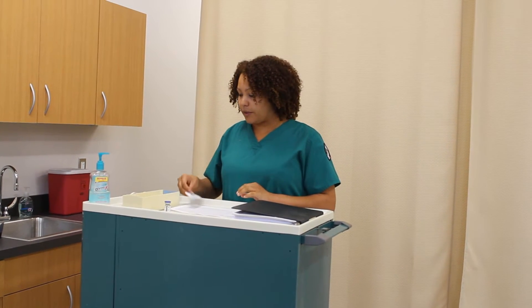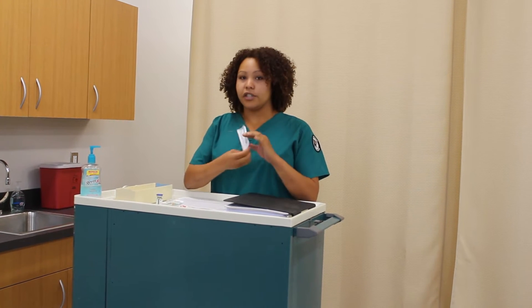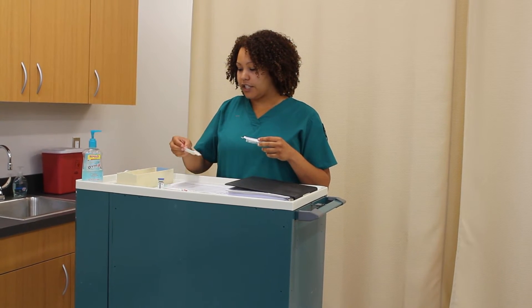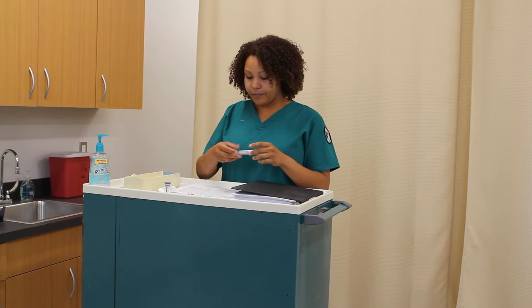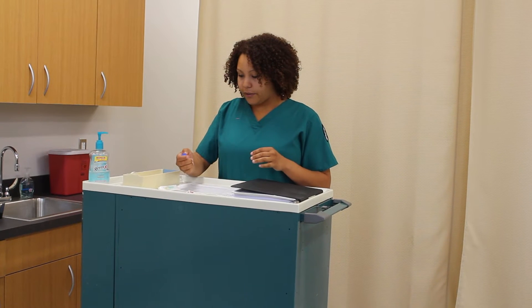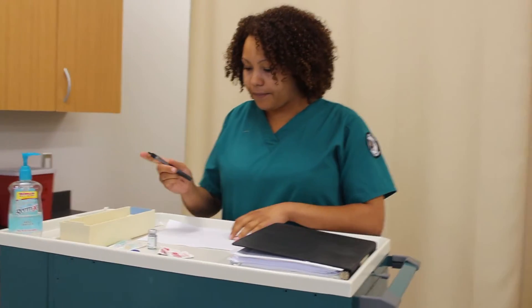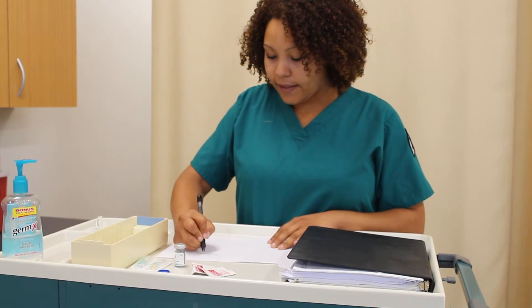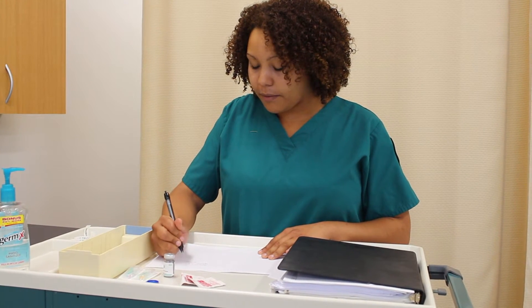My second check would be to draw up the medication and get everything ready for administration. I have my three milliliter syringe to draw the medication with. I have my 18 gauge needle, and then I'll change it to my 25 gauge 5/8 inch needle for the subcutaneous injection. My desired dose is 5,000 units; I have 10,000 units per milliliter, so I'll draw up 0.5 milliliters of heparin.